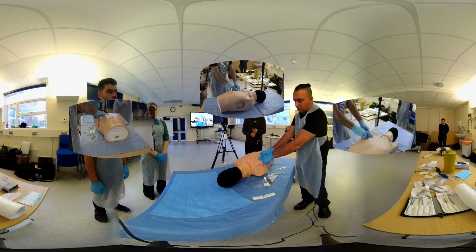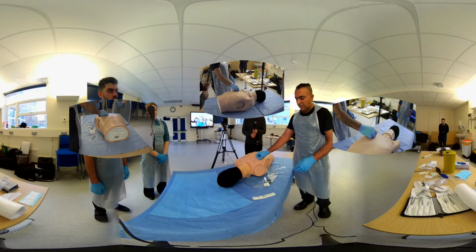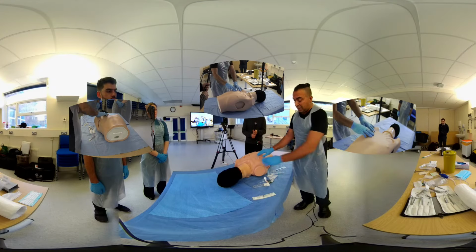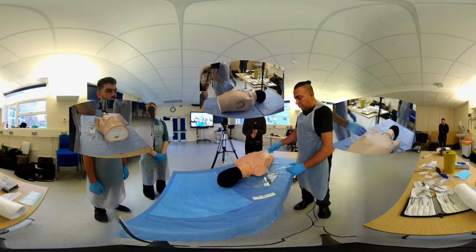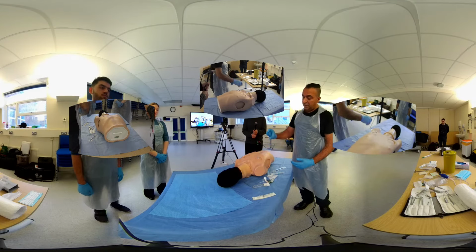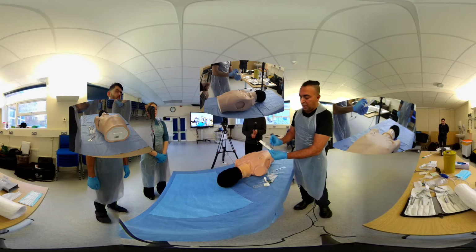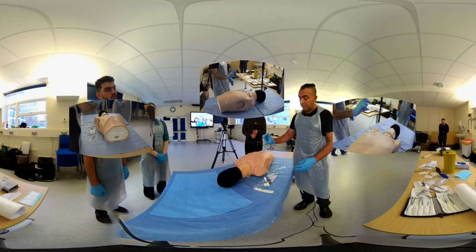This then is unstable, so you need to get some sort of padding or some sort of dressing in place, sticky tape to be there. But the worry is, and the potential is, as that's been done, patients wriggling around or regaining consciousness, or their arms moving, etc., that this then dislodges. It's not that big in reality. If you look at this one, it's not that big in reality, and your anterior chest wall could be deeper than that in somebody with obesity.